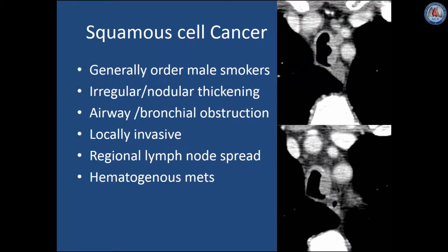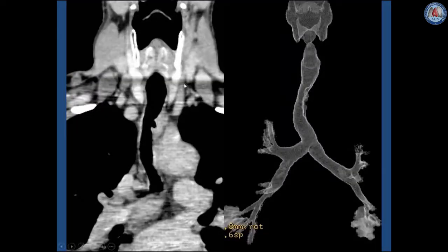Squamous cell cancers of the trachea generally occur in male smokers. These are irregular nodular tumors that cause narrowing of the trachea, thickening of the wall, and often extend into the adjacent soft tissue by local invasion. They are associated with regional lymph node spread and hematogenous metastases. A coronal image demonstrates a nodular area of thickening in the left lateral wall of the trachea, also seen on 3D surface rendering.